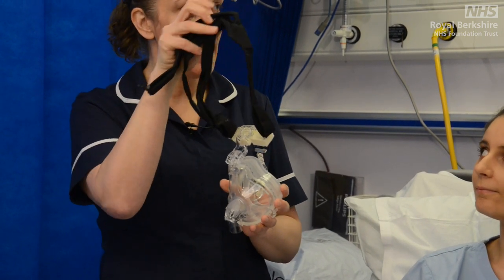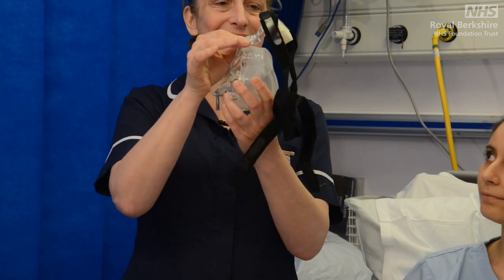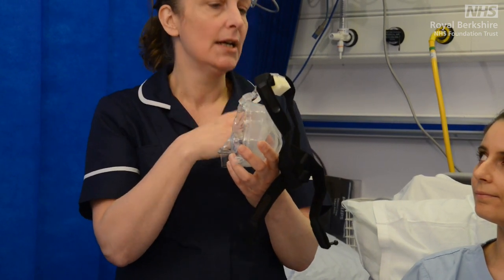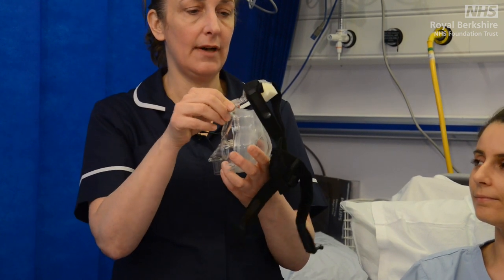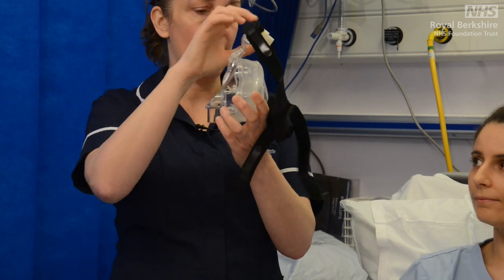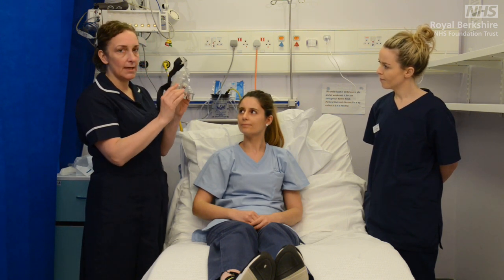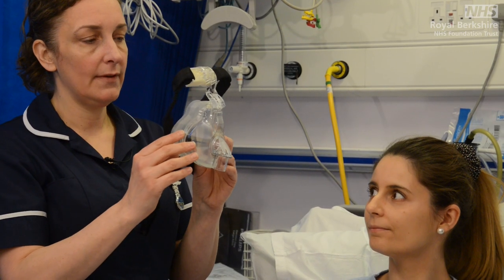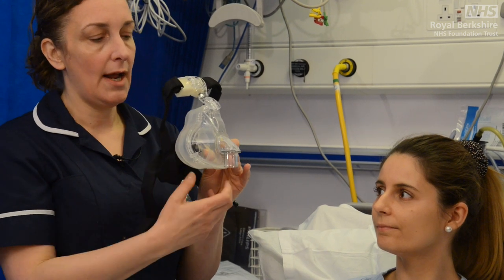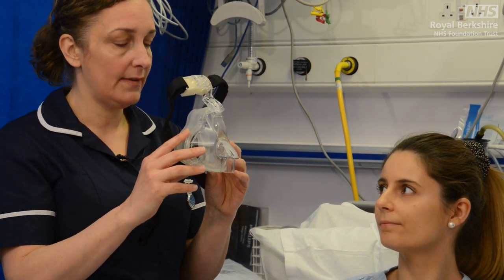We then have our harness, which will eventually sit over our patient's head — we'll go through how to fit that in a moment. The other key component is this articulated section of the mask, and this is key in getting really good mask fitting, which in turn will increase patient compliance with non-invasive ventilation. It moves backwards and forwards, and this top section also angles at the top. The key thing is that this vertical line here needs to remain in a vertical position at all times. If the mask tilts, it increases pressure on one point of the face and allows much more leak at the bottom, meaning we wouldn't get the ventilation we were seeking.